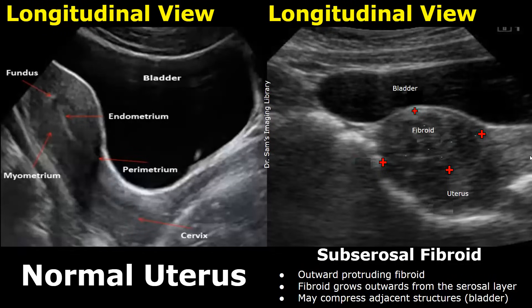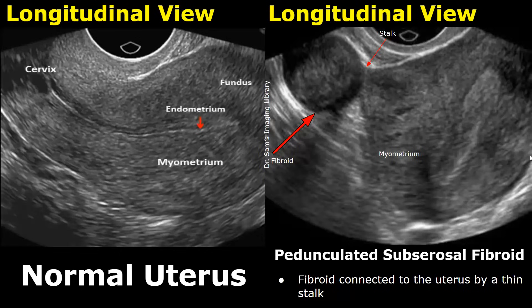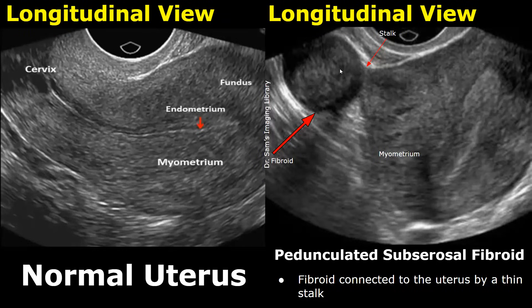Some types of subserosal fibroids are pedunculated, which means the fibroid is connected to the uterus by a thin stalk. There is a thin connection between the uterus and the fibroid, so if we see this type of appearance we will call it a pedunculated subserosal fibroid.